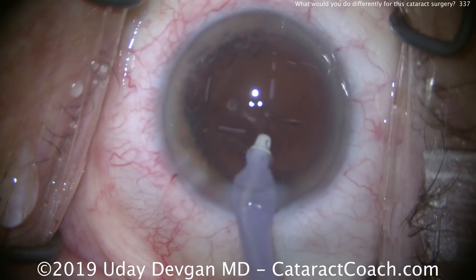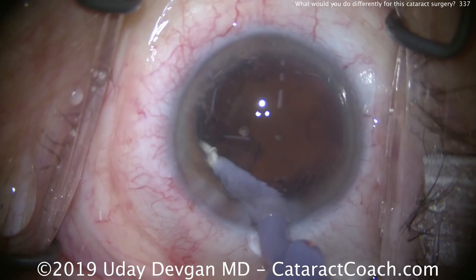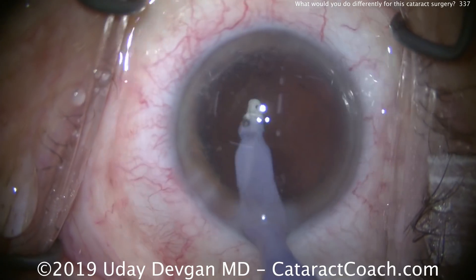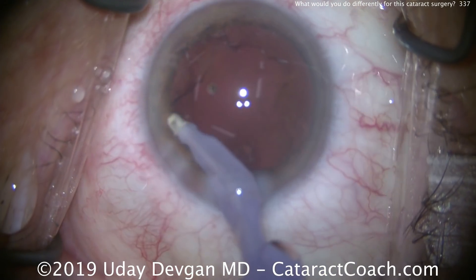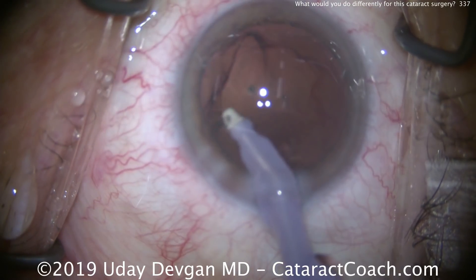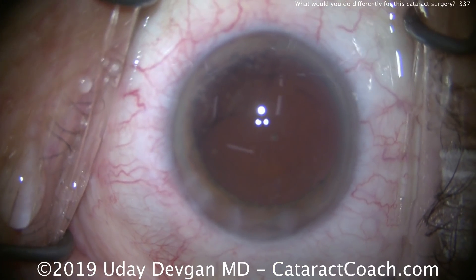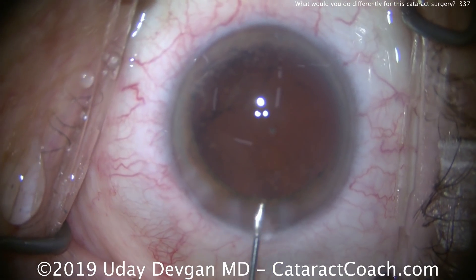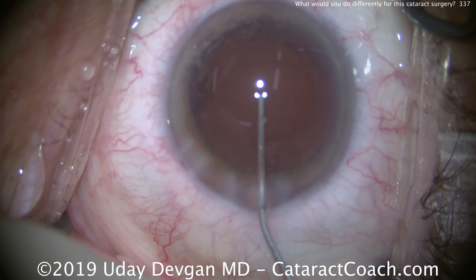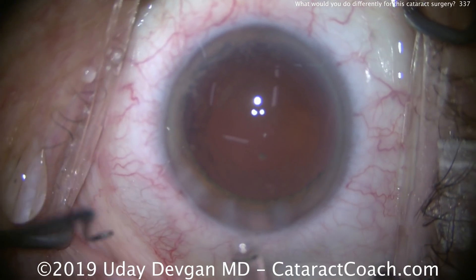The things that are going to damage the endothelium are ultrasonic energy — more energy is worse for the cornea — and the amount of fluid that runs through the eye. Remember that the volume of the anterior chamber is probably a quarter of a cc, and even including the posterior chamber, the full anterior segment volume is about a half cc. If you're running 500 cc's of balanced salt solution through the eye, that's excessive — that's a thousand times turnover. You should be able to complete a case like this with 50 cc's of fluid or less.